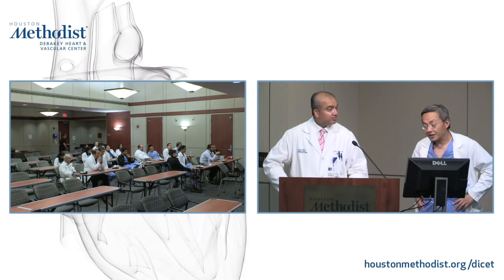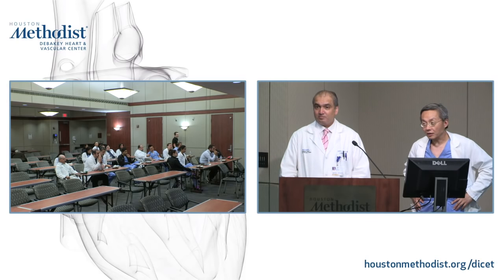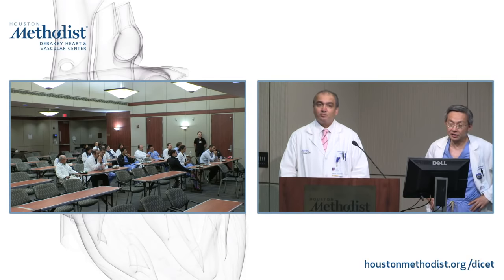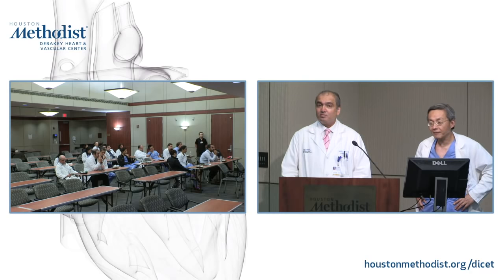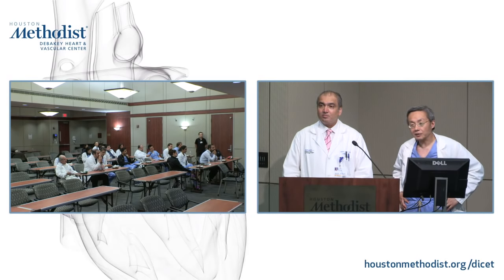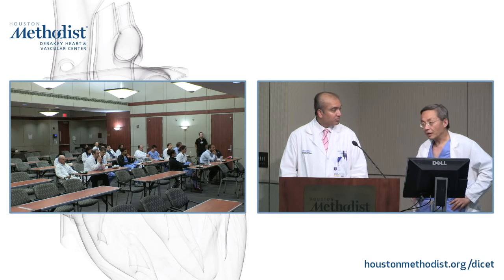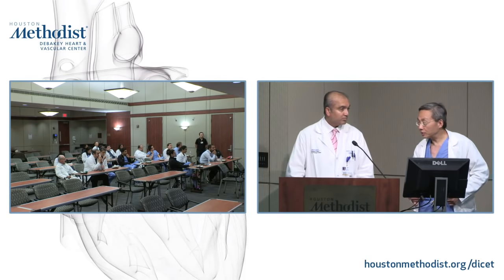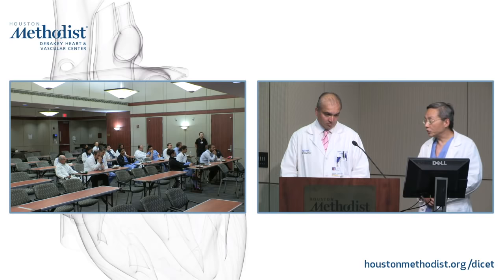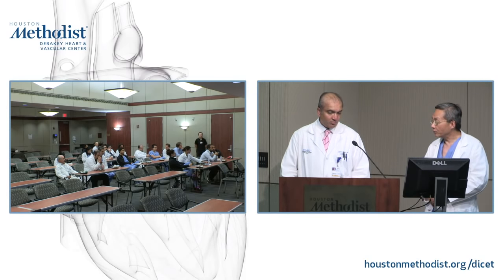In that case, unless you have really superb image quality CT, where we can get a lot of contrast down where the prosthesis is and a slow heart rate, it could be useful. And obviously, if there's concern of any abscess, especially fistula, color Doppler is really the one that makes the real difference. I think MRI is the same. I think the main advantage of MRI is to look at the direction, location, and whether there's any abnormal jet. I don't know how good the resolution is in terms of the jet size for you to pick up some.